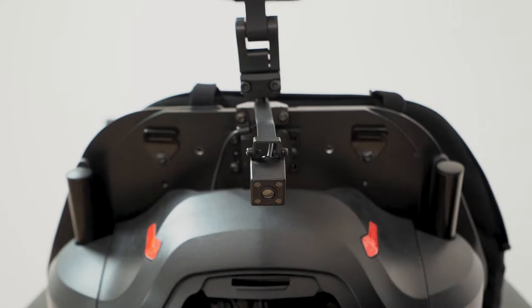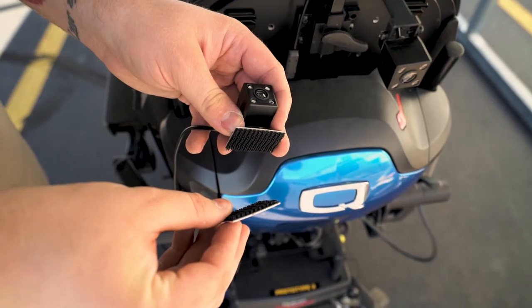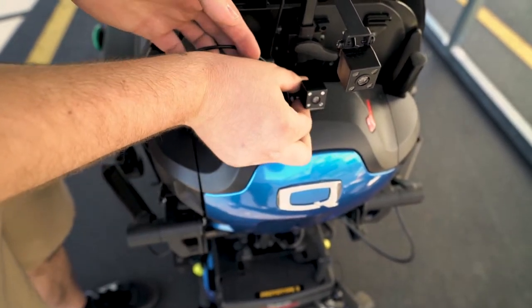Now we will install the camera. The camera can be installed in a myriad of locations. We include 3M dual lock so that the ATP or clinician can determine with the client what the best camera location is. When installing the camera with the dual lock, please be sure the camera is installed in a place where it won't be crushed by any of the power seat functions.